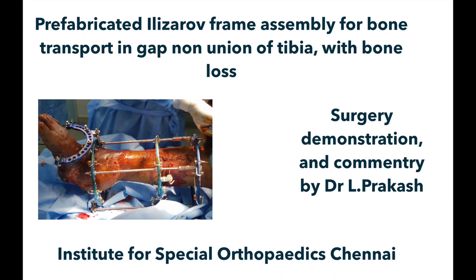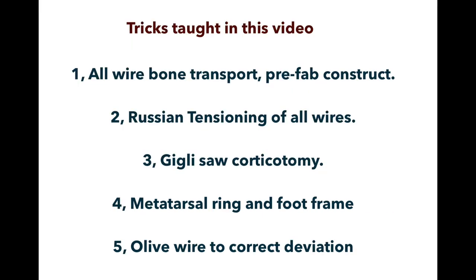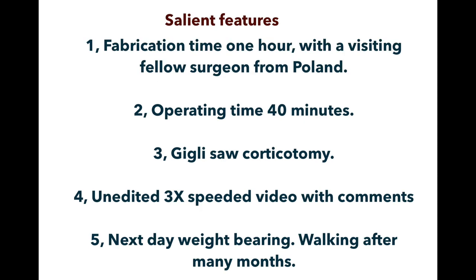This is a demonstration of a pre-fabricated Elizarov frame assembly for bone transport in gap non-union of the tibia. The patient sustained a road traffic accident with segmental bone loss, underwent external fixation and plastic procedures, and has now come for the final definitive procedure. This is an all-wire bone transport pre-fabricated construct using Russian tensioning of wires and a giggly saw for osteotomy. The video is unedited at 3x speed with comments.